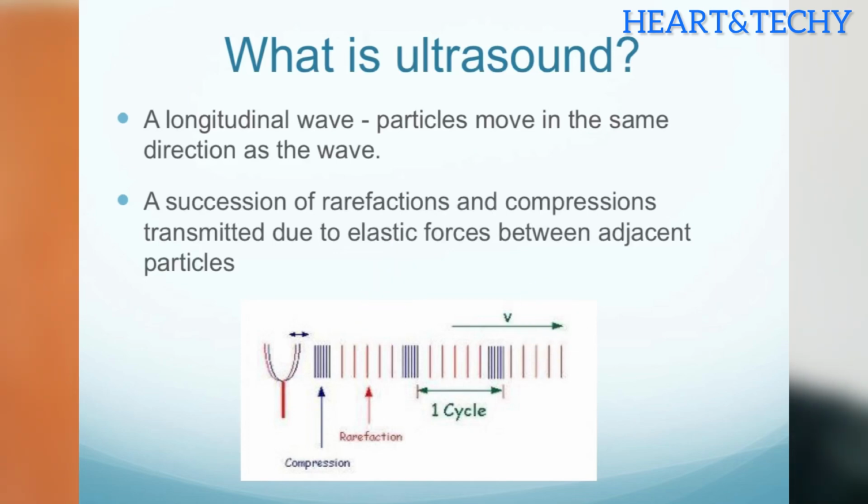This ultrasound moves in a longitudinal way, so it moves through a single direction. That is mainly what we mean.